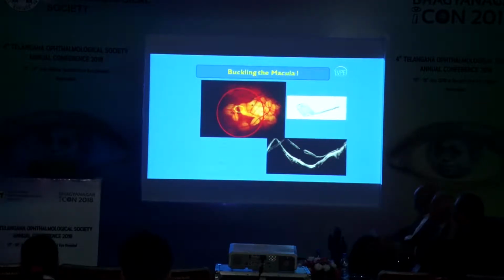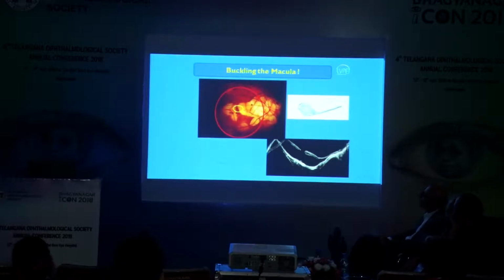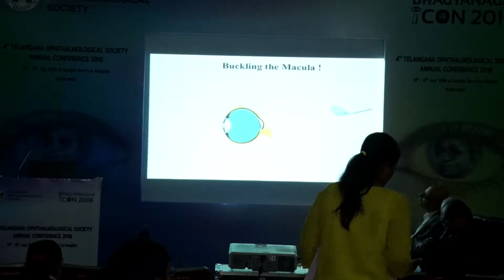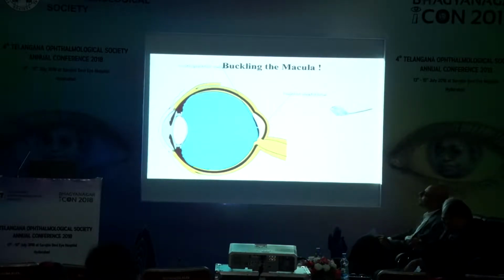The image here shows the fundus of a highly myopic eye with a macular hole labeled by a yellow circle and the associated retinal detachment marked by a red circle. The OCT image shows a full thickness macular hole with posterior pole retinal detachment. The pathophysiology is caused by the vitreoretinal interface, the presence of posterior staphyloma, and weak adhesions between the neurosensory retina and retinal pigment epithelium.